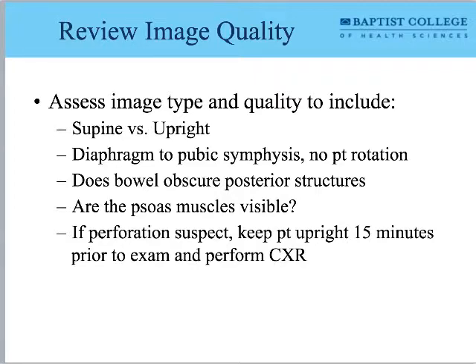And so one good question is, are the psoas muscles visible? That's a good technologist question to ask, because it allows us to determine whether or not there's an appropriate amount of image contrast visible. And then if there's perforation suspected, we want to keep the patient upright for at least 15 minutes prior to the exam. And then we also want to ask whether or not we should be doing a chest x-ray, because they want to look at if there's air trapped beneath the diaphragm within the peritoneum.